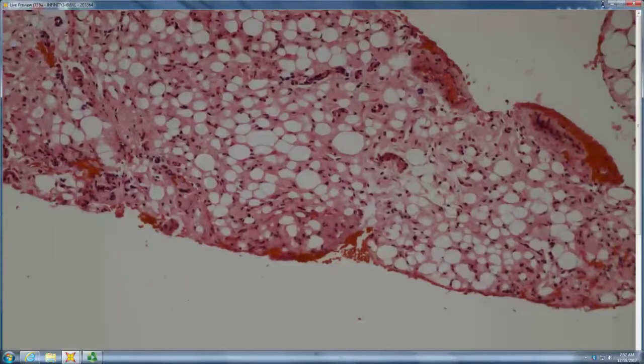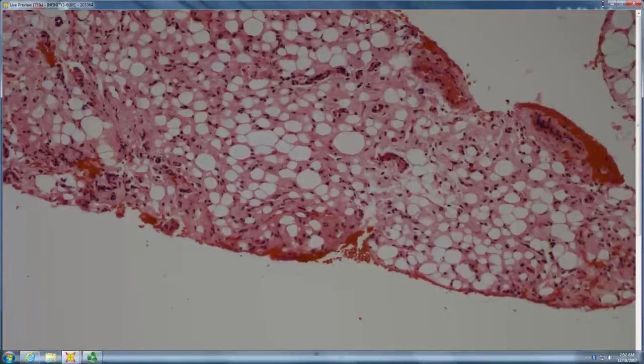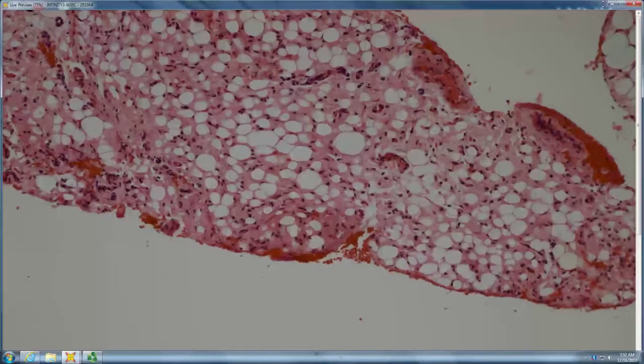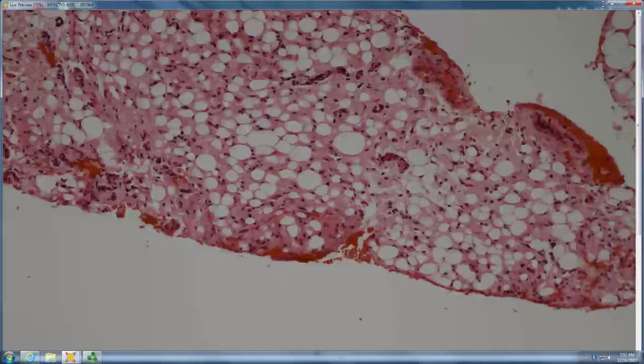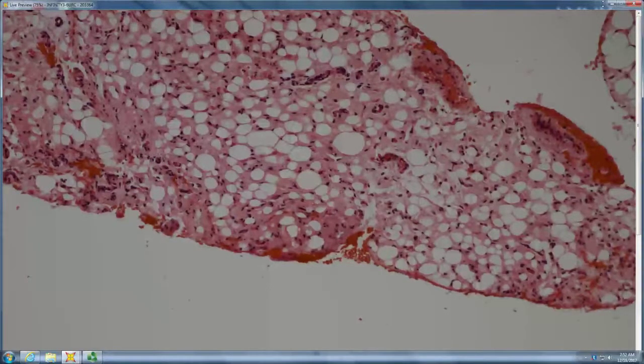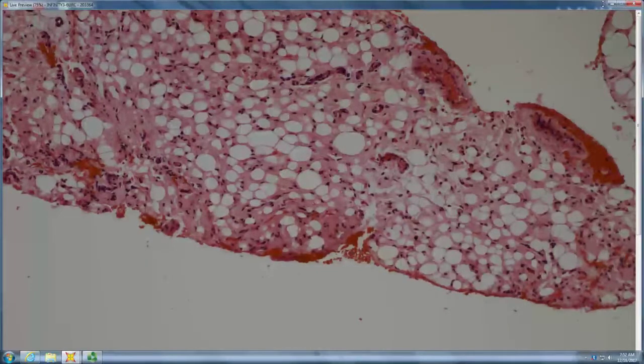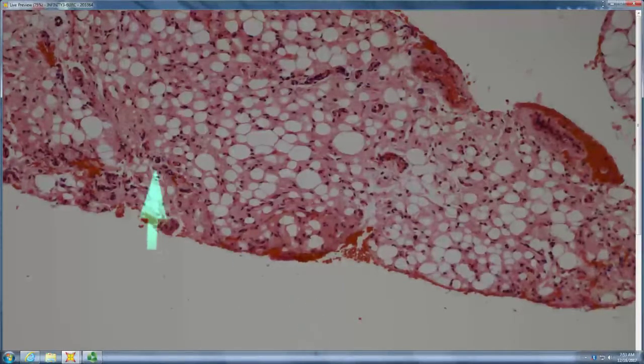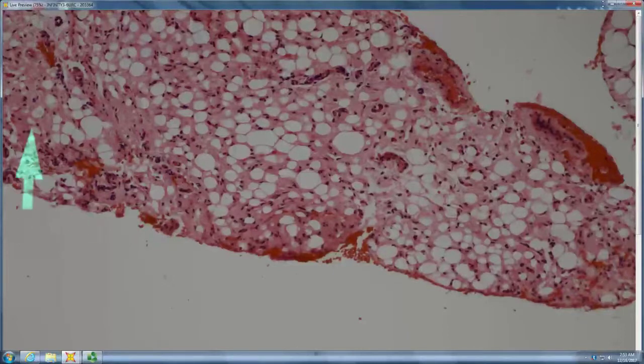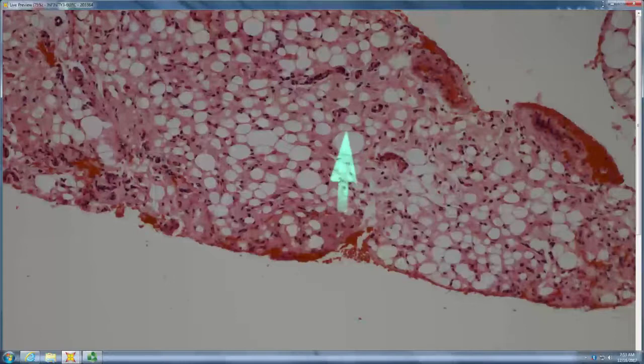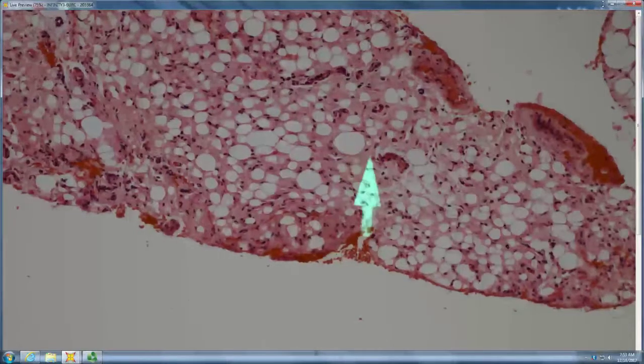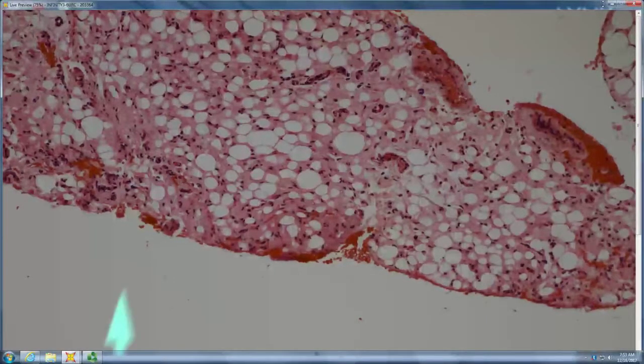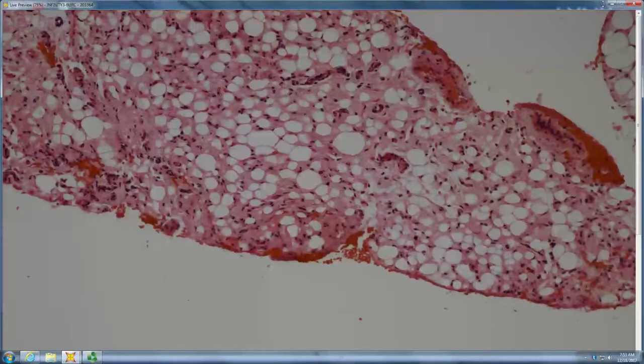So what do you see there? So I see, looks like lobular. Yeah, looks like lobular. Looks like there's some inflammatory cells in there. So in this case, there are a few inflammatory cells, and the biggest thing is that's about the size of a normal lipocyte. So in lobular, you have big ones and little ones, but the big ones are too big. So is this more like lipoatrophy? This is lipoatrophy, correct.